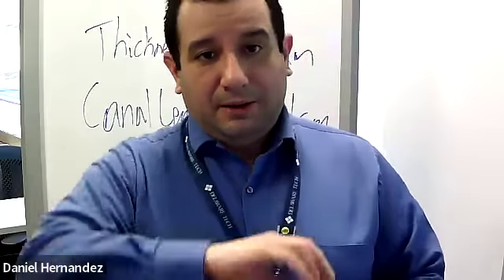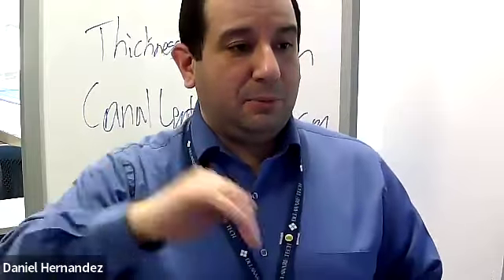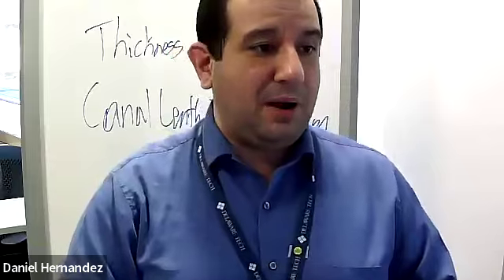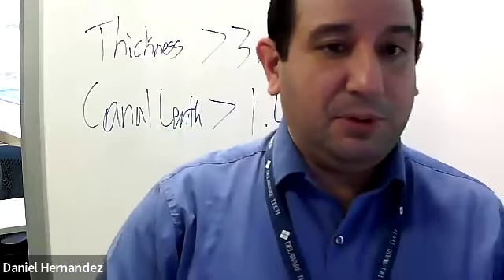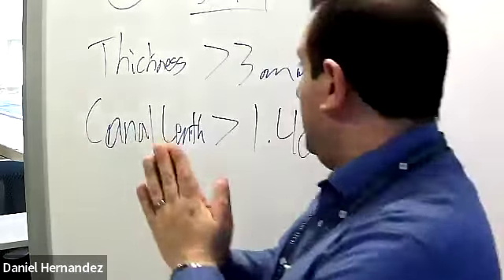Like I said, channel length can be a little more challenging to image, particularly if it's curved and angled more posteriorly. If you're not using an open trace to trace it properly, you can be slightly off, but really rely on thickness. The thickness is what the issue is, and that thickness eventually closes it off and prevents things from passing. That's a good caveat I want to mention.